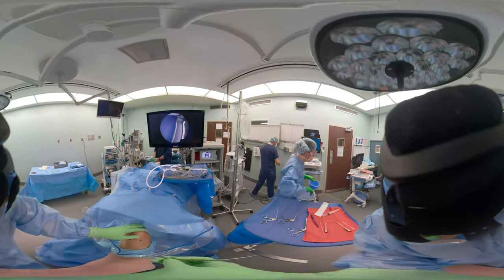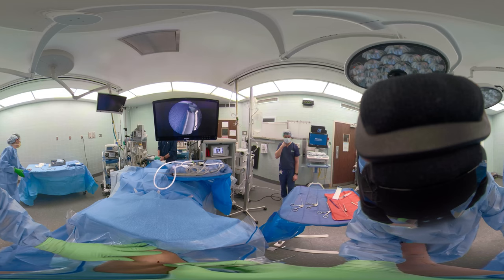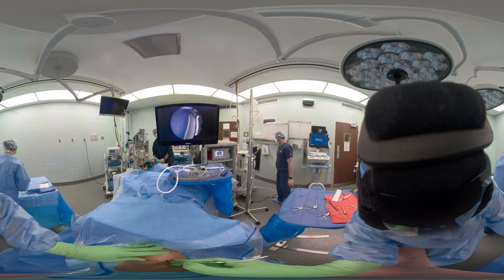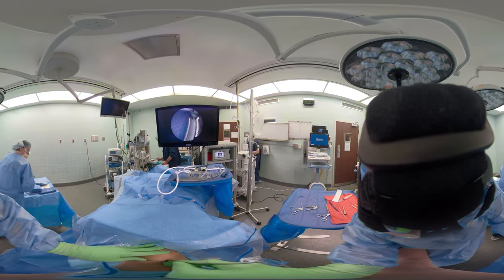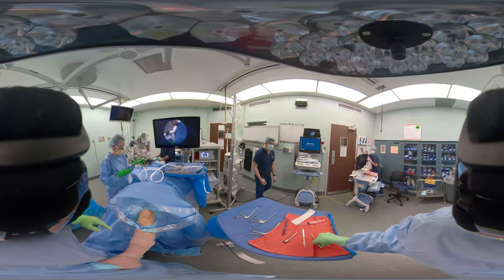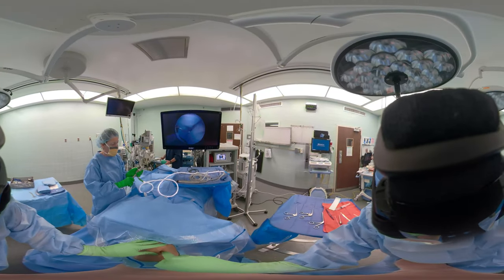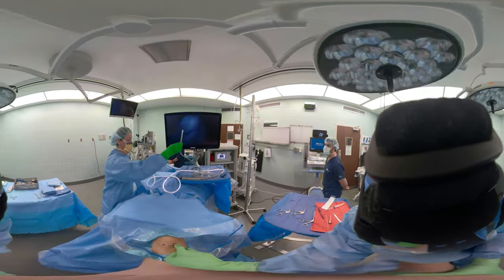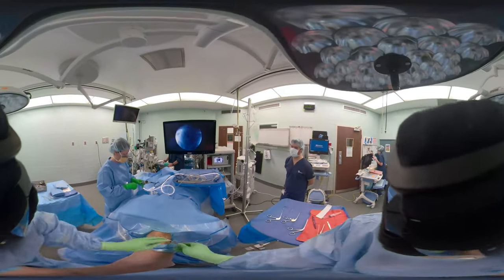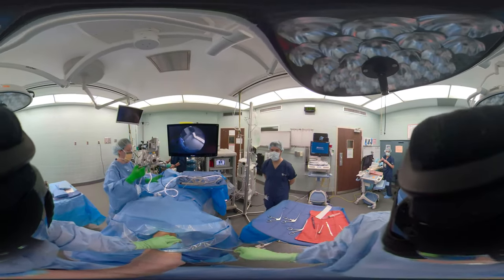Here is our portal incision, lateral. This is a left knee. Again, go deep — make a big enough mini arthrotomy so that we can get the cannula in and move around easily. This is a big cannula with a blunt obturator with the knee in about 30 degrees of flexion. Then going out to extension, you go ahead and put the cannula into the suprapatellar pouch. You can then see if there's any fluid or hemarthrosis on the inside of the knee.